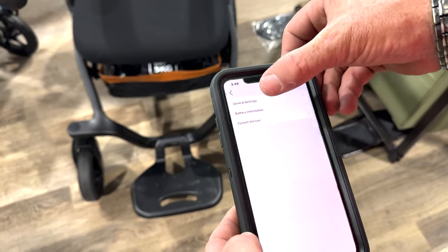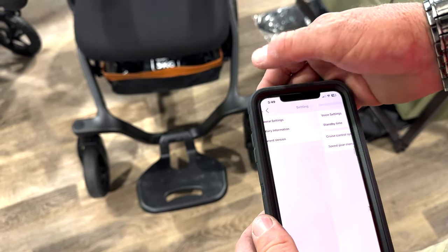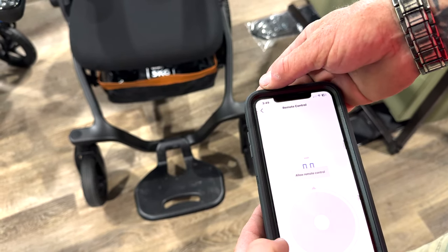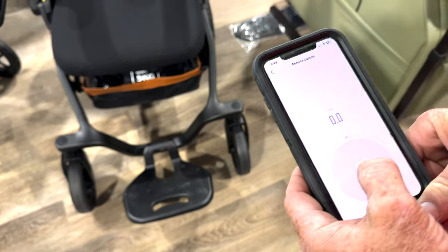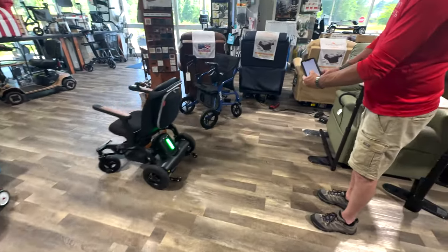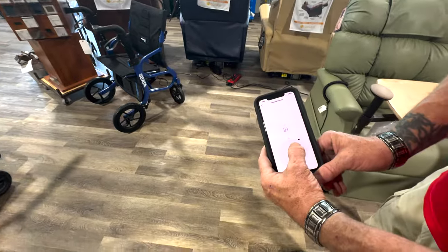You can adjust. You got your generals. You can do voice settings, your time, your cruise control, speed, gear memory, battery information, current version. And if you want to do remote control, right there, and we're ready. This would be the center, and start remote control. So there you go. That's how you operate it. Go back into that settings.